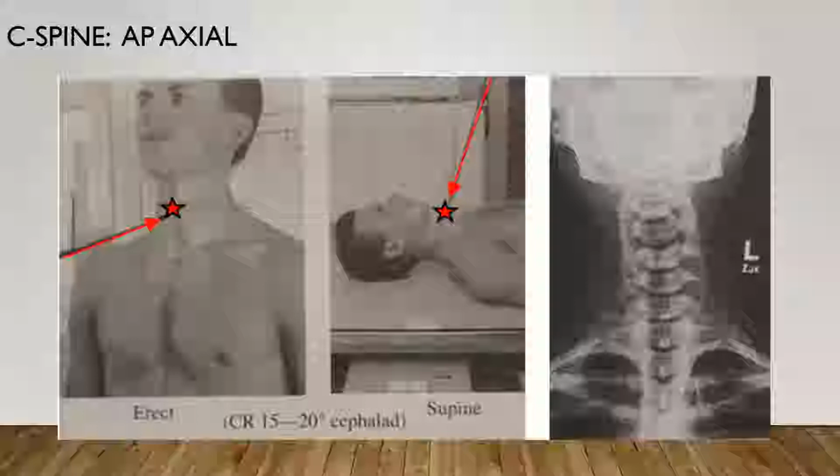If you have a trauma patient, do not remove the cervical collar and do not move the head or neck until authorized by a physician who has evaluated the horizontal beam lateral image or the CT scan of the cervical spine.